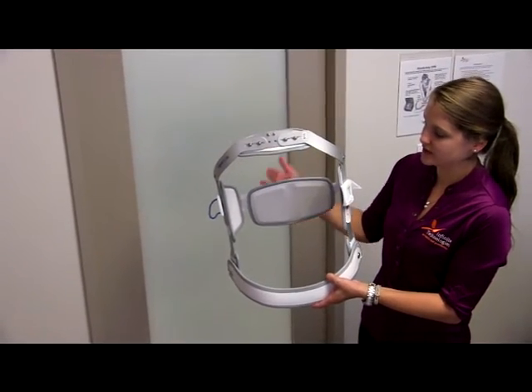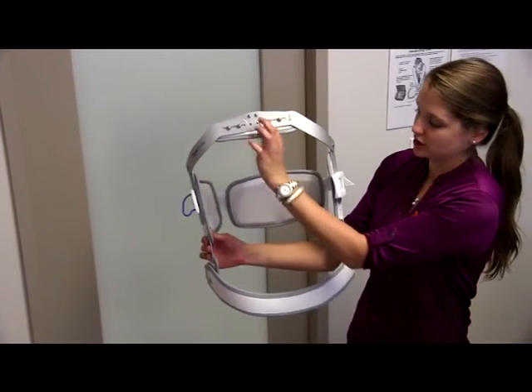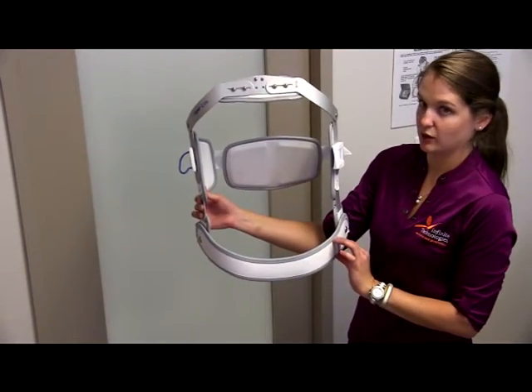First we're going to orient ourselves with the brace. This is the front section with the top portion here and the bottom portion here. This piece is going to be resting on the patient's chest, and this pelvic portion is going to be coming across her hips.